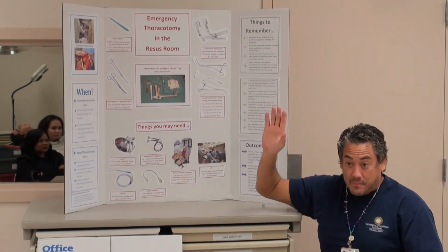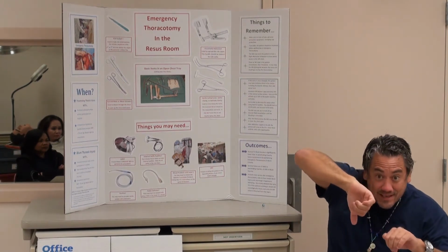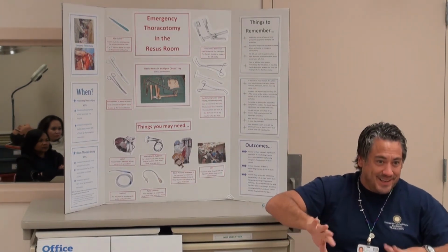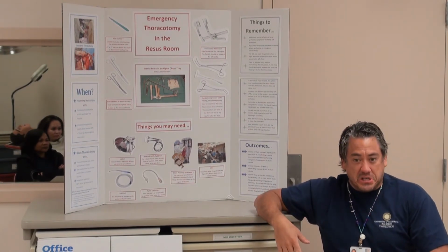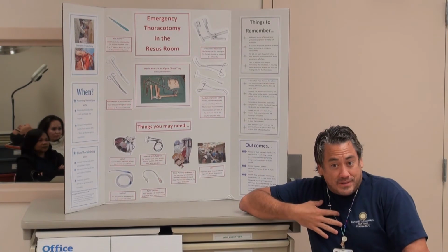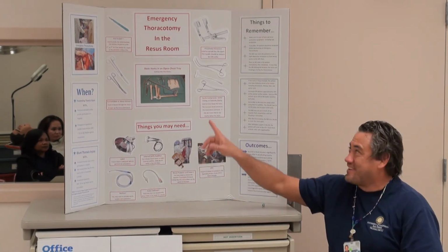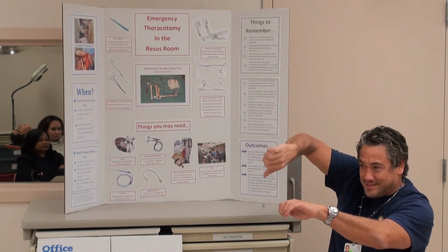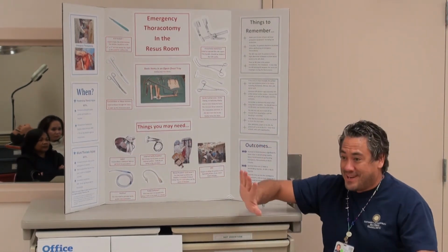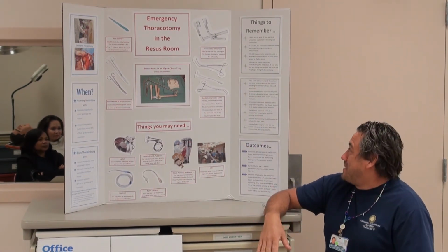The doctor put the thing on backwards, so the little arms weren't going the right way and it wouldn't open the chest, and they yelled at us, "You should know how to put it together." No, that is not for us to know. But if you see someone fumbling around putting it together, and the arms aren't going to open up the chest, maybe you say something. That's kind of all I figure our job is.